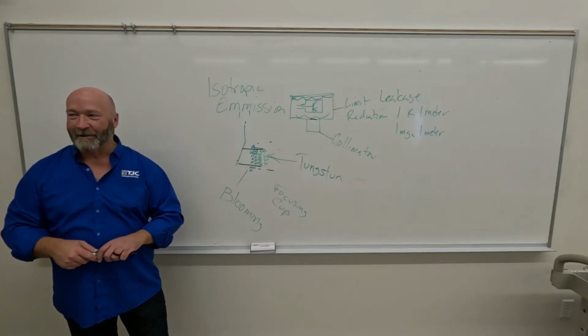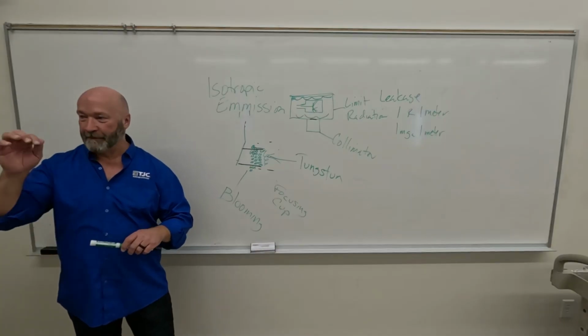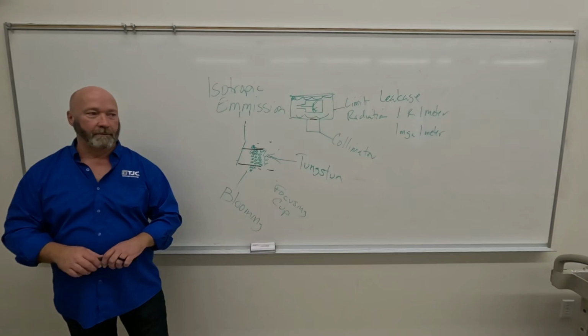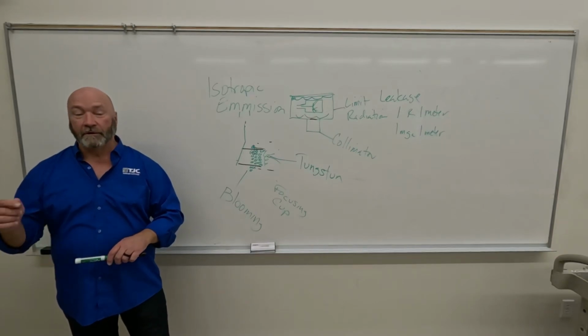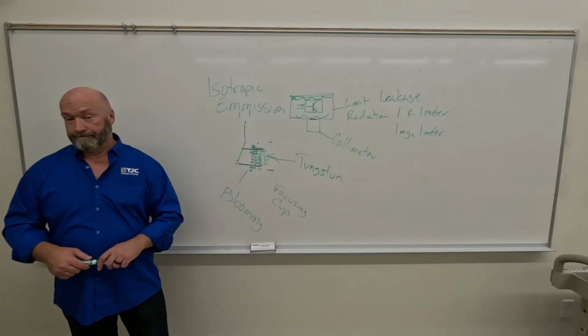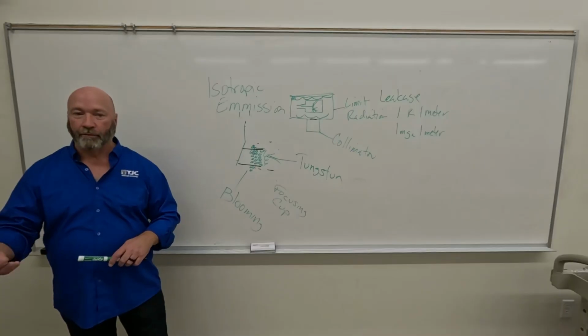It feeds, yeah. So you get this big roll of tungsten, don't knock it over, whatever you do. Because if you do, you gotta go get a broom. Tungsten is brittle. Okay, so it's got a high atomic number, but it's very brittle.